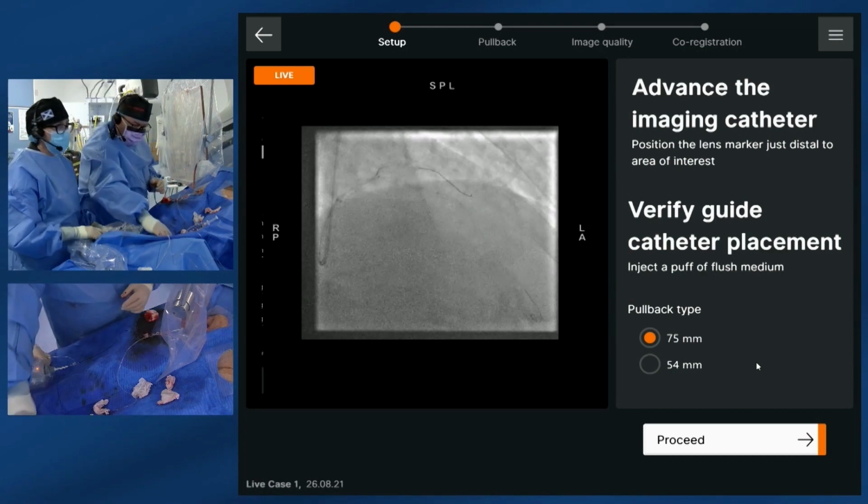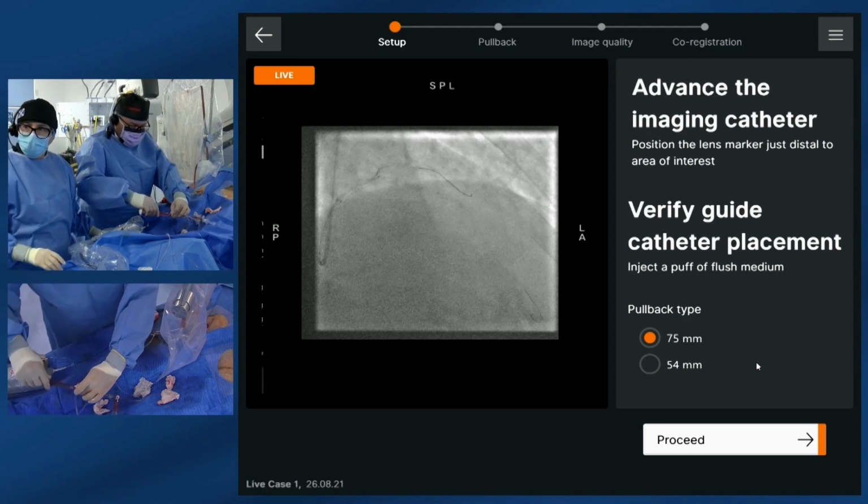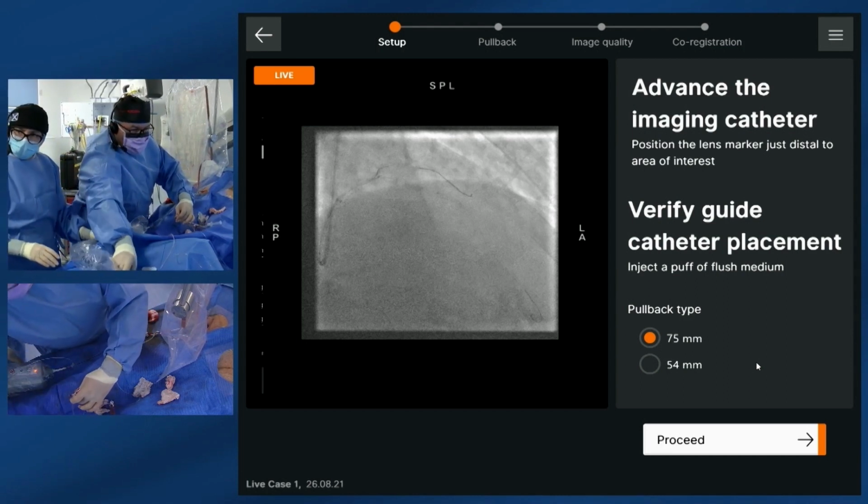Yeah, absolutely. Okay, can we swap to the bigger syringe, please? Do you want to come down to the caudal view again, Nicola, P caudal?